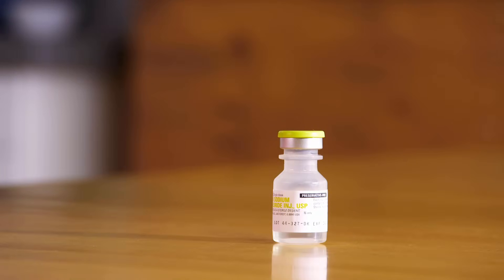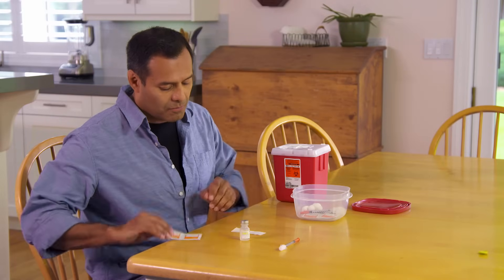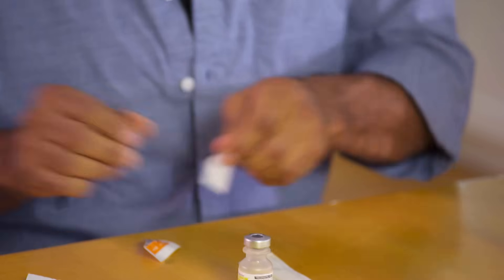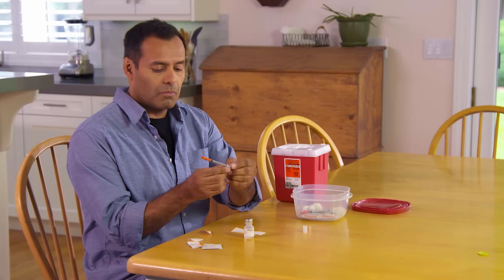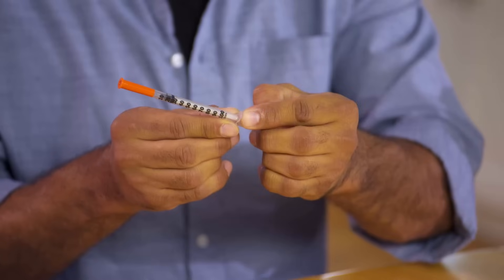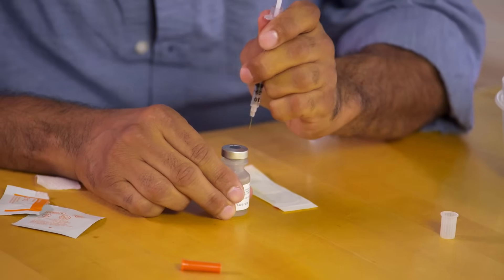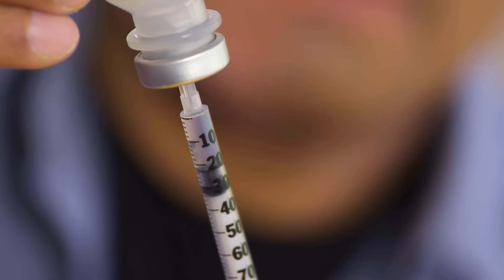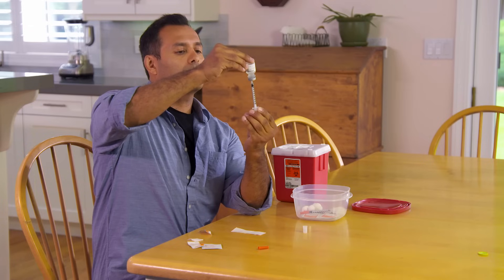Check the expiration date on your medicine. If you have a new vial, it may come with a plastic cap — pop that off first. Then wipe the top of the vial with an alcohol pad or swab and let it dry for a few seconds. Next, take the cap off the plunger. Now draw air into the syringe by pulling the plunger back to the prescribed unit mark. Then very carefully uncap the syringe, set the cap aside, and stick the needle through the top of the vial. Flip the needle and vial over and inject the air into the vial by slowly pushing the plunger all the way in.